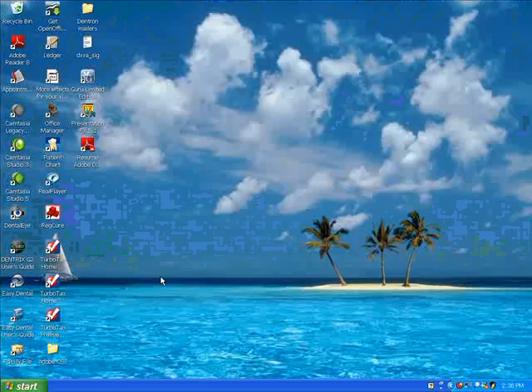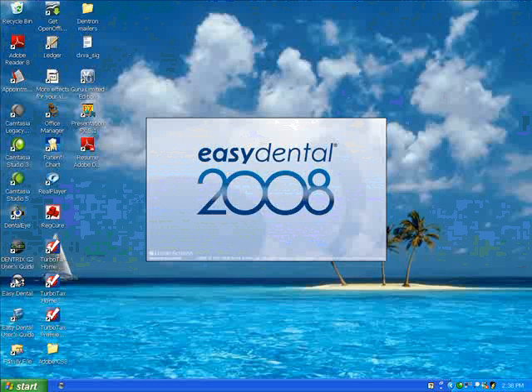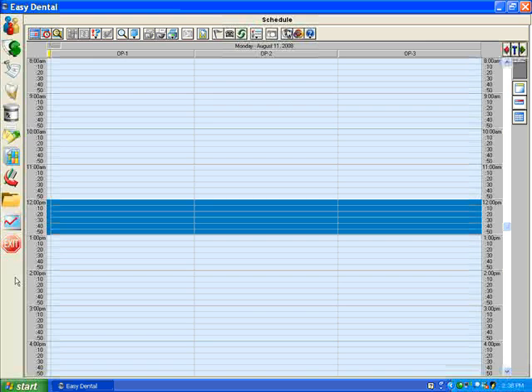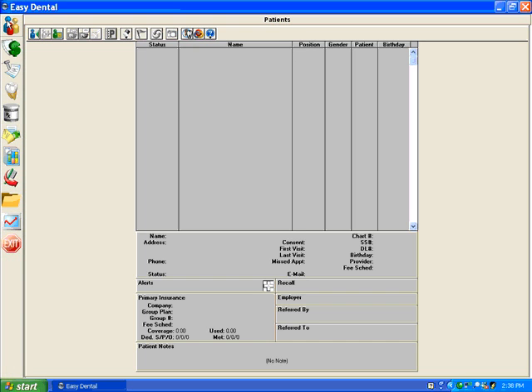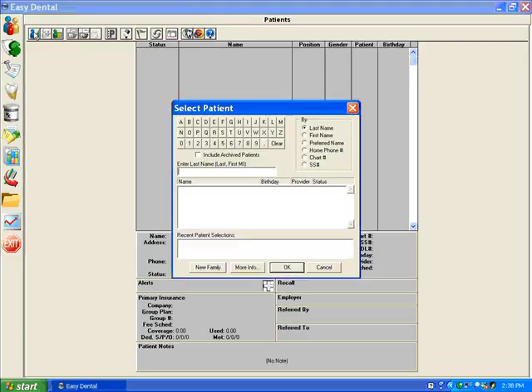This will demonstrate the integration between Easy Dental 2008 and Dental Eye. First, open Easy Dental 2008, then select a patient.